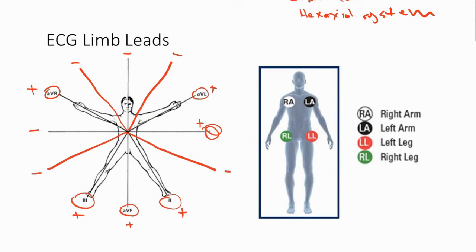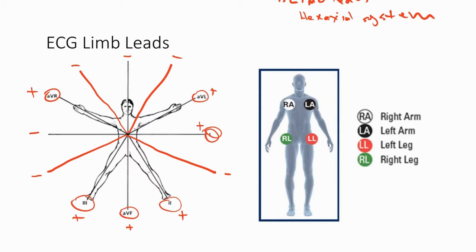And really, this is no different than what adult ER residents are learning and interpreting on their patients as well, right? Exactly the same. In terms of the mechanism of analyzing the EKG using a vectorial approach and the setup, this is exactly the same in children and adults.